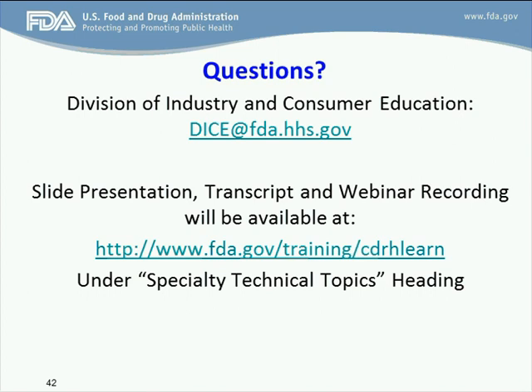So basically what we are saying is, if you are aware of any issues, any post-market issues that have occurred, those considerations need to be taken into account. And if you look at page 7 of the guidance, we have provided a couple of examples where you should address the specific aspects such as actions that require substantial dexterity or strength, good visual acuity, familiarity with uncommon processes. So those are the kind of things that need specific attention when you validate and provide your reprocessing instructions. Okay. Thank you so much.